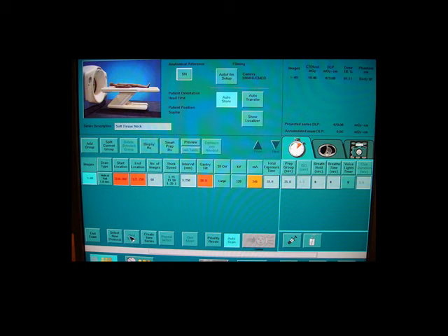And here's your protocol. Again, you'll go to your localizer, and you'll localize where you will be centering on the mid-sagittal plane. Your localizer will go from the top of the EAM to the aortic arch. And you will center on those, both on your AP and your lateral, but there's no angulation for a soft tissue neck.